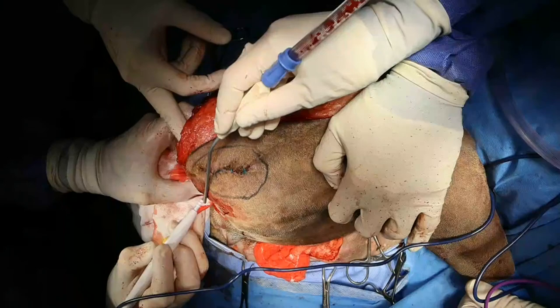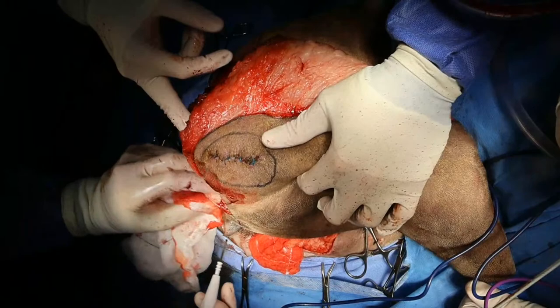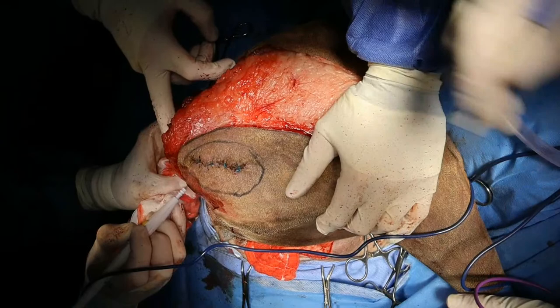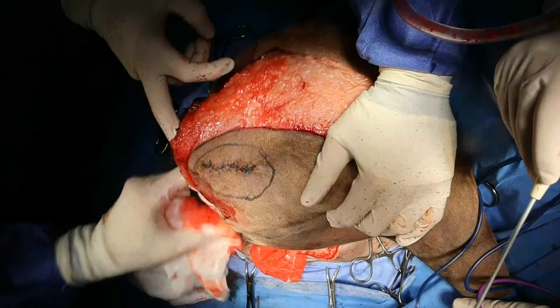So that's down to ischiocavernosus there. Just be careful that I'm not cutting any part of the urethra, because it is very, very close to here.